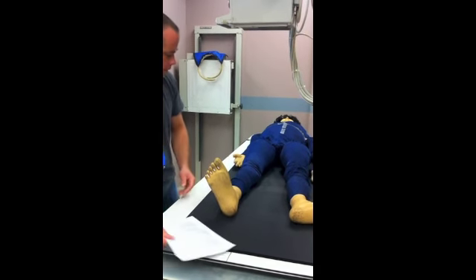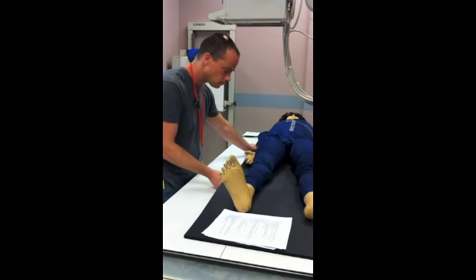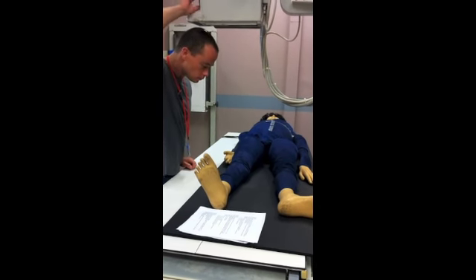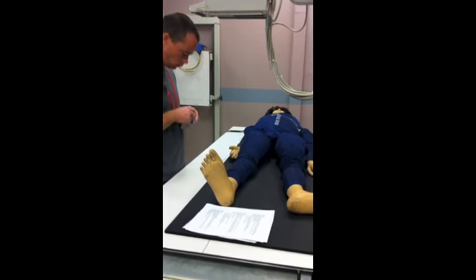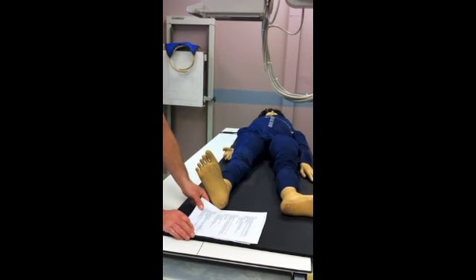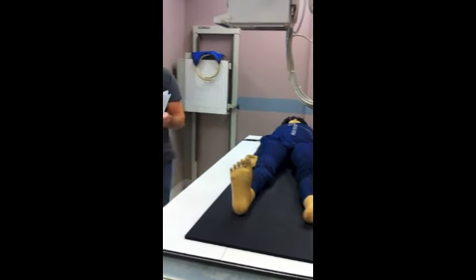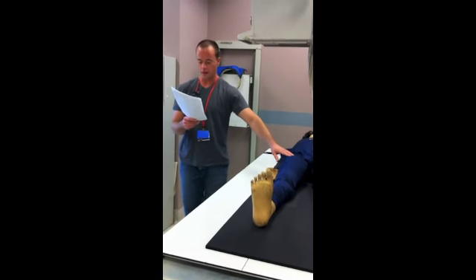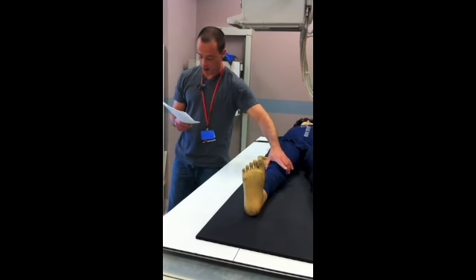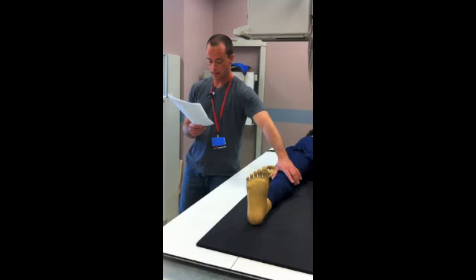I'm going to have to position the patient myself. So the patient is supine on the table, pelvis is not rotated, the IR is under the patient's knee, and we want the femoral condyles to be parallel with the table. That is a position for a true AP.